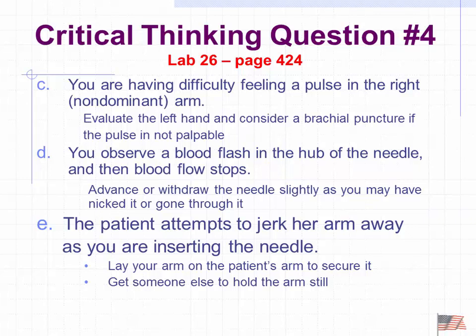Patient attempts to jerk her arm away as you're inserting the needle. This is where duct tape works. No, I'm just kidding. That's why you want to position yourself so your hand is on there so they can't move.